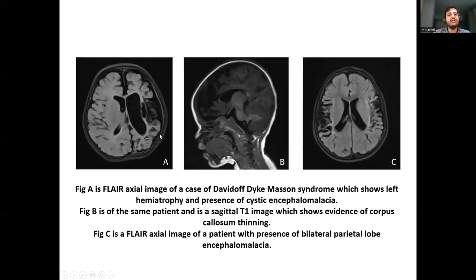A FLAIR axial image of a case of Davidoff-Dyke-Mason syndrome shows left hemiatrophy and cystic encephalomalacia. Figure B is a sagittal T1 image of the same patient showing corpus callosal thinning. Figure C is a FLAIR image of a patient with bilateral parietal lobe encephalomalacia.